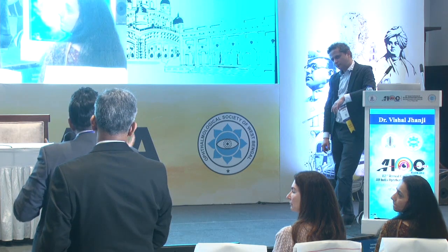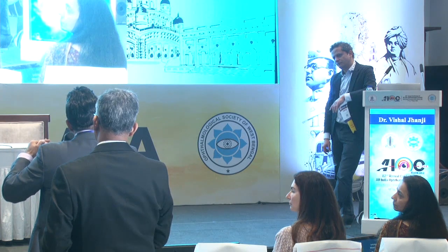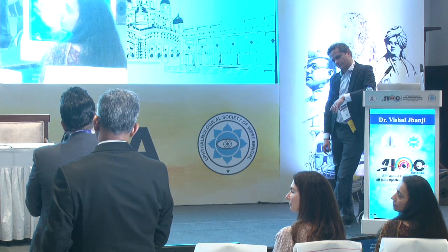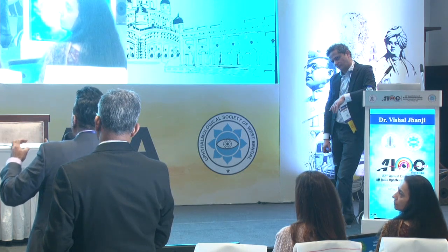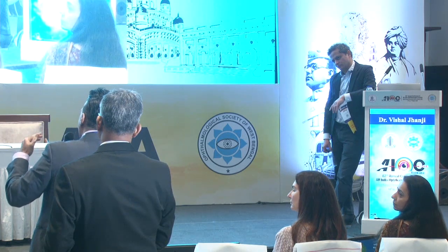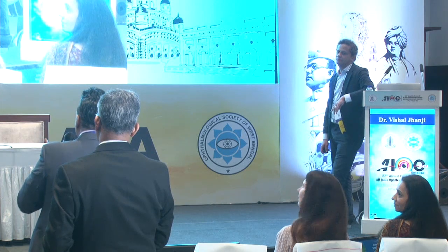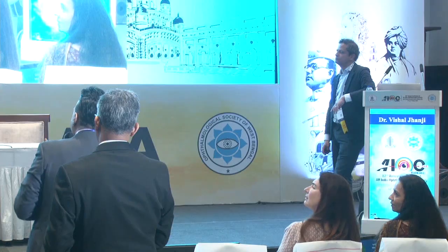And actually what we're doing now is on the Pentacam, you can put up densitometry, and you can adjust your posterior densitometry. It's preset, I think, at 60 microns from the back and 120 at the front. And you can adjust the posterior one to be 30 microns away from Descemet's membrane. It's just a scale bar. It's very simple to do. And that gives you a very good idea of backscatter for the patients as well. And if they have high levels of densitometry abnormality, then I will do a triple as opposed to doing a primary procedure. And I noticed there were a lot of patients that didn't have an abnormal posterior float but had high levels of densitometry scarring. And that affects my decision making.